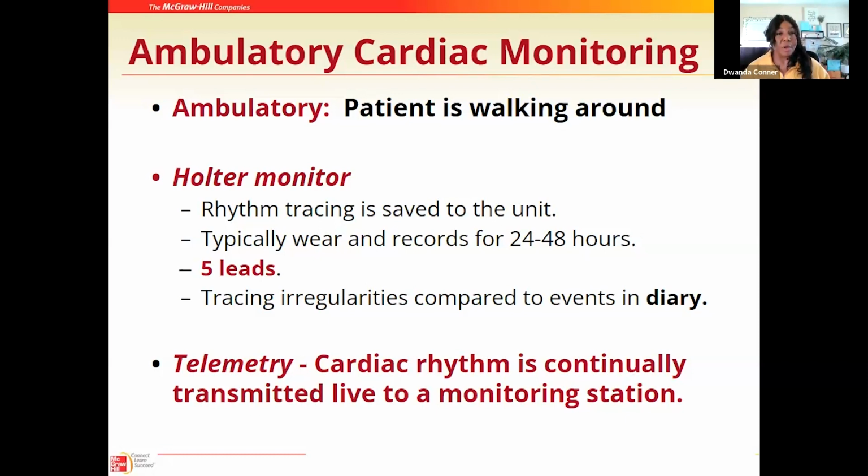However, it is portable. And so it is tracking the rhythm and the rate of a patient's heart, and it's saving it into a device that we can then take and plug into our computer, and it's going to give us a rhythm strip, a printout. What changes here is the amount of time that the patient can wear this portable Holter monitor. So typically 24 to 48 hours. However, it wouldn't be abnormal to see someone wear this for longer periods of time.